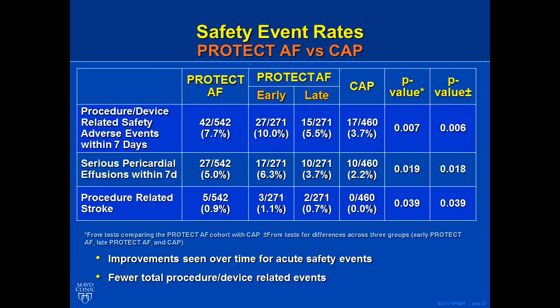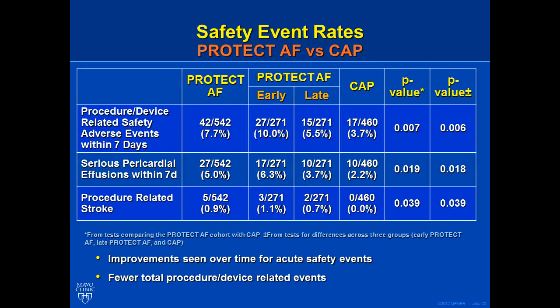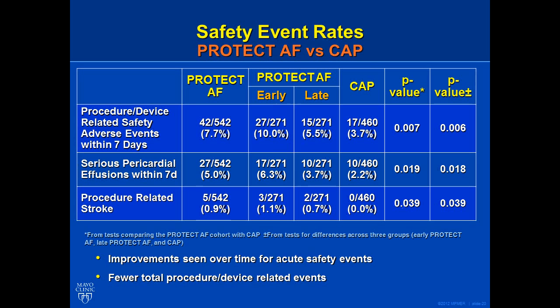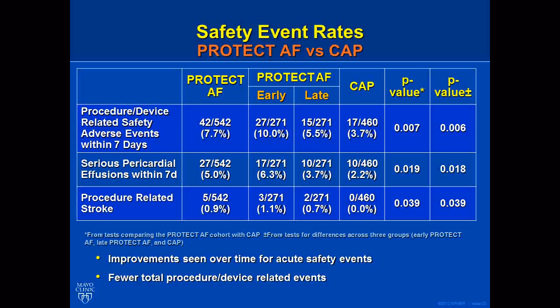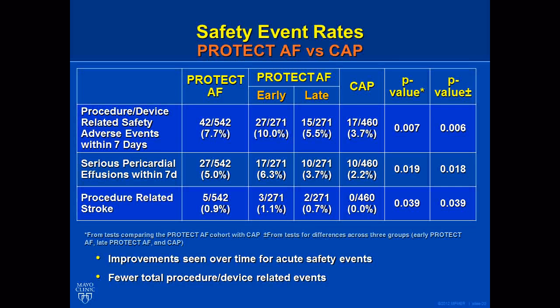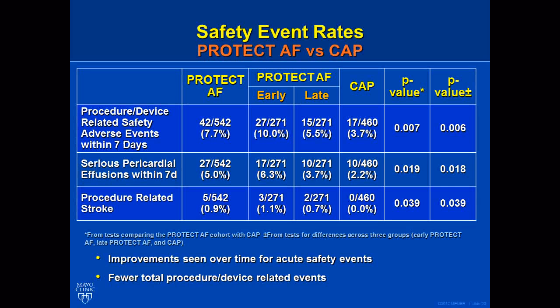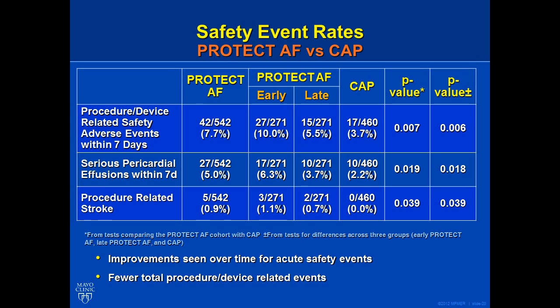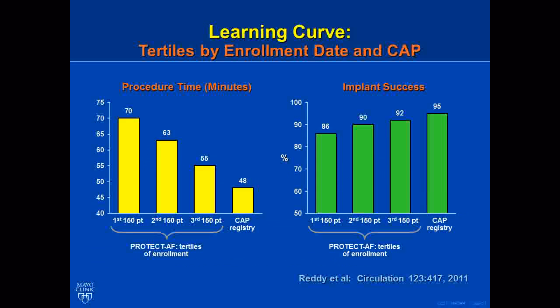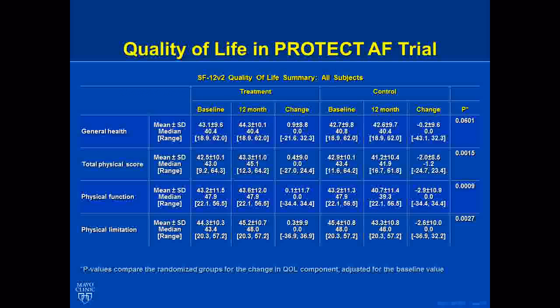What are the other things? You're familiar with the implant success. Is that still important? Well, it gets better and better and better. Procedure time, is that a terribly important metric? Well, it's felt by some to be a metric. We heard about the fact that, for example, if you were going to do transpericardial access and then had to put in a second device, some of the time it's a long procedure. Or if you add to the procedure ablation, then you're going to talk about procedural times that increase dramatically, irrespective of whether you put in a left atrial appendage occlusion device. Learning curve, we know about that. Implant success is better. Procedure time, as I mentioned, is better.